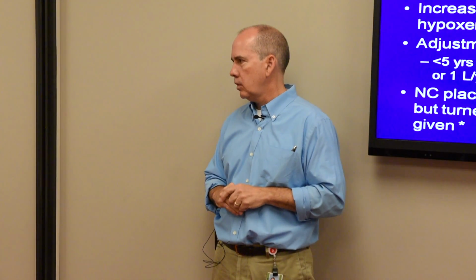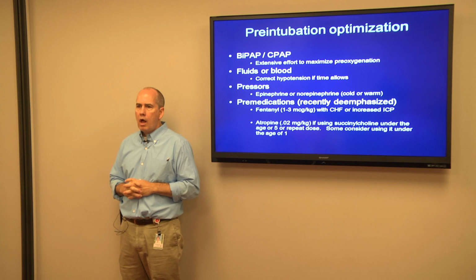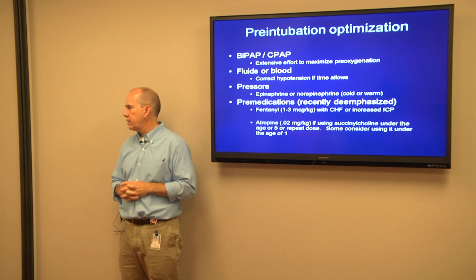But it's a little too cumbersome for RTs to set up the high flow nasal cannula just for the purpose of apneic oxygenation. So we use a standard nasal cannula for that. Questions about that? So it has become the standard for this, right? Pre-intubation optimization, what we talked about.